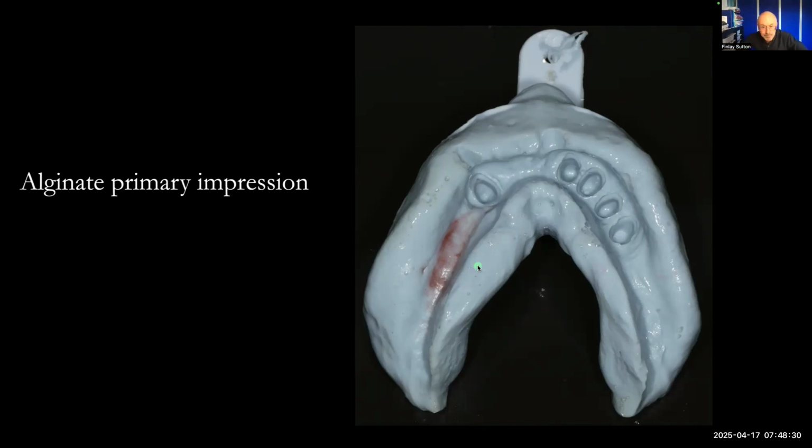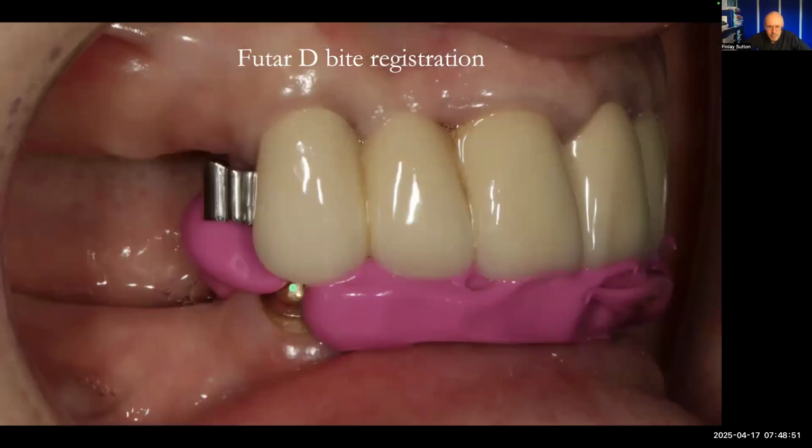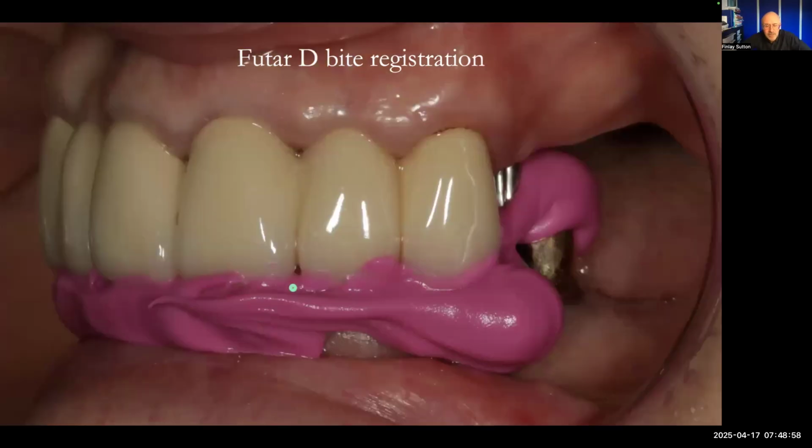So that's great. The other thing I did at this appointment, because I wanted to mount these just to have a look at them, is this isn't for producing the final restoration. It's purely for study casts. I did a bite registration using Futar, the bite registration material. I just got the patient to close together in approximately the intercuspal position.